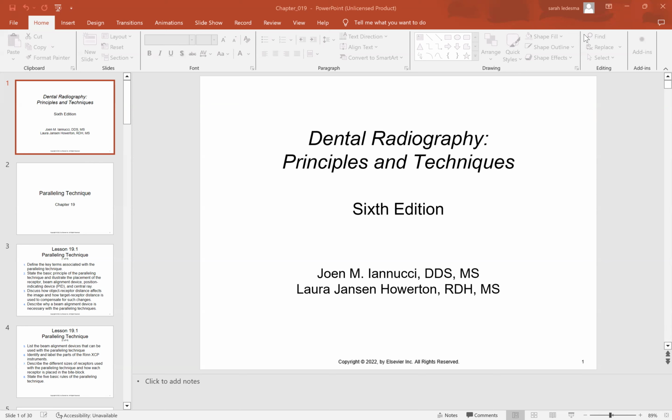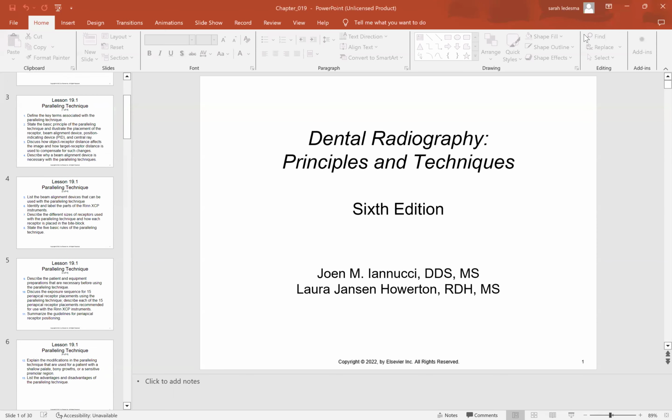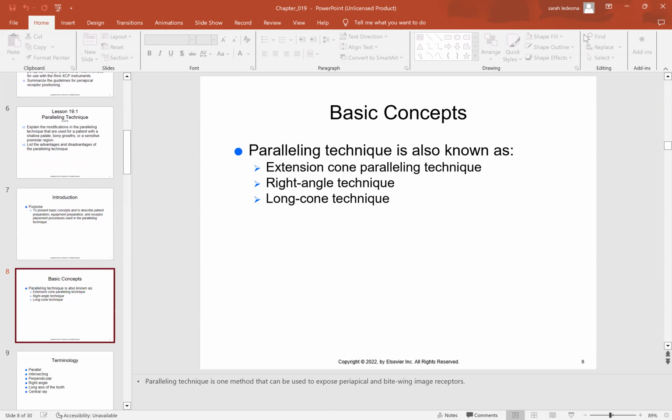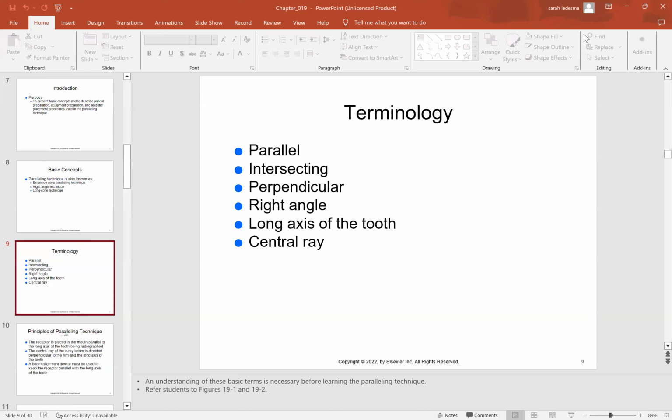Video lecture chapter 19, Paralleling Technique, Dental Radiography, Principles and Techniques. Basic concepts. Paralleling technique is also known as extension cone paralleling technique, right angle technique, or long cone technique. Some terminology used: parallel, intersecting, perpendicular, right angle, long axis of the tooth, and central ray.